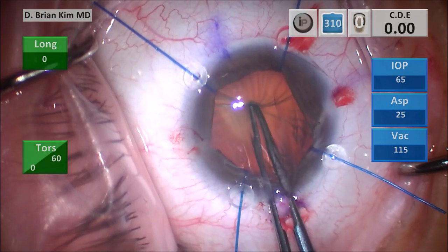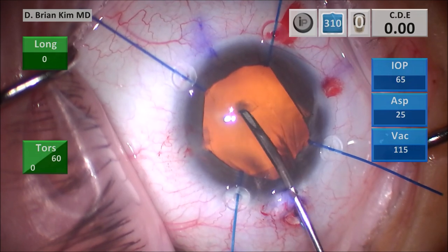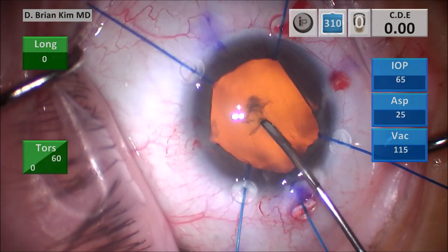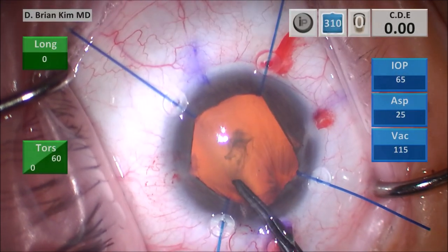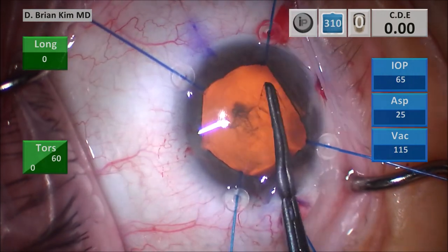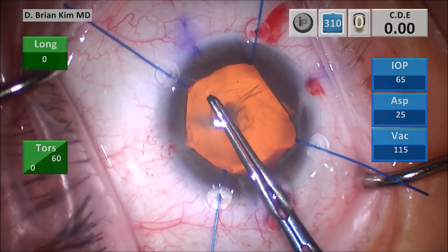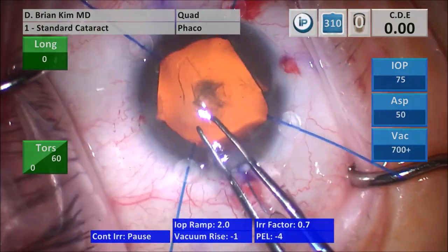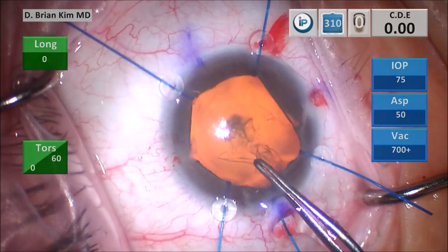I'm using a puncture-style capsulorrhexis, however I quickly realized that the zonules are very weak — there is hardly any counter force when I'm pushing down with the forceps. So I decide to go with the cystotome and make a little cut and then a little flap. I try to go circumferentially with my forceps following the corneal marks. Fortunately I didn't encounter difficulty doing the rexis. Perhaps this is less about zonular damage and more about zonular laxity due to her high myopia.